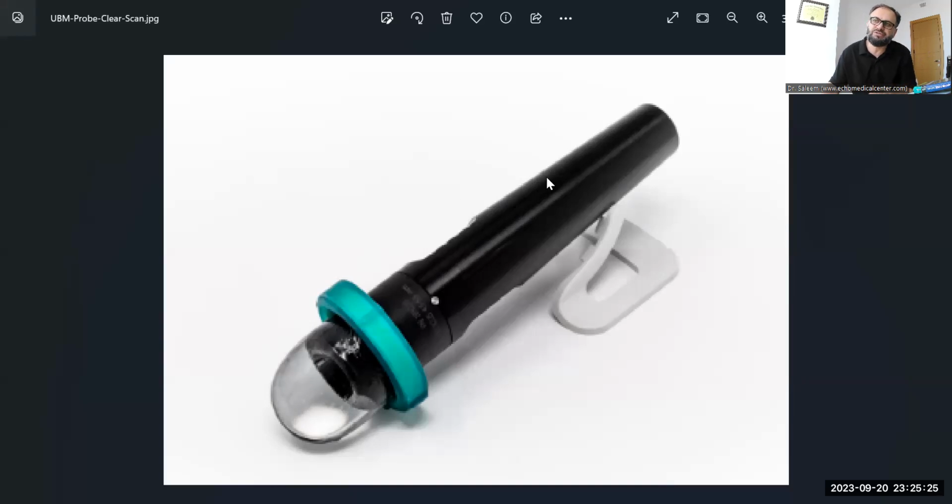So now if you're using this high frequency transducer, for sure you will not face that dead zone. It's completely gone now because this is all gel. So you're going to touch this portion of this transducer to that human body where you're scanning. So now that dead zone is gone. Now you can see exactly if it's something subcutaneous, you will be able to see it. So the dead zone is gone here.